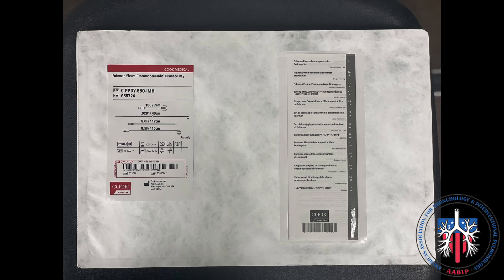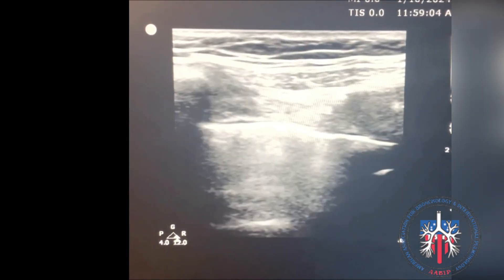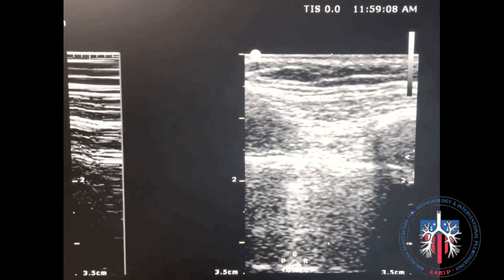The kit used in this video is the Fulman Plural and Pneumopericardial Drain by Cook Medical. Before the procedure, we confirmed the absence of lung sliding on lung ultrasound both in B-mode and M-mode.